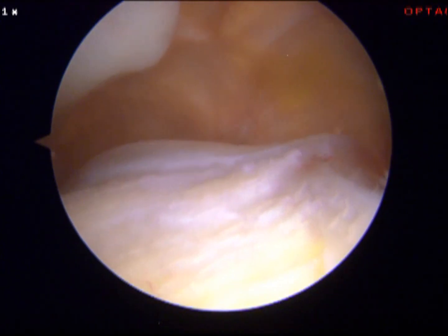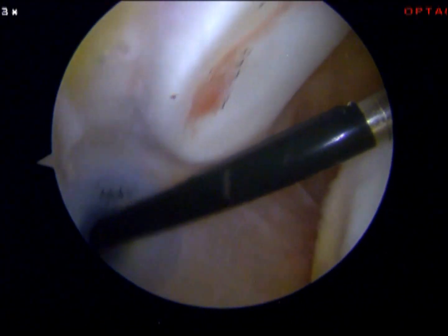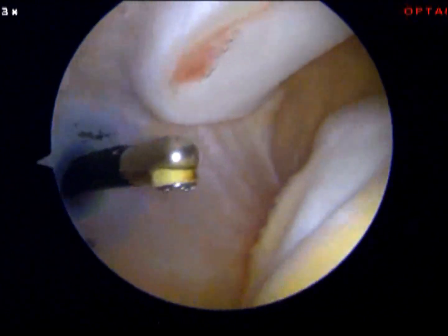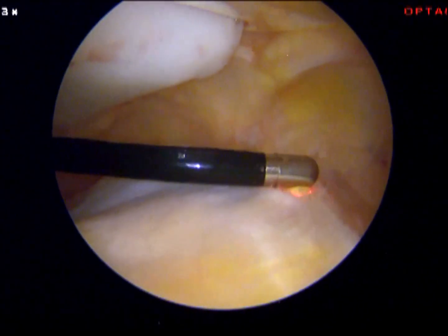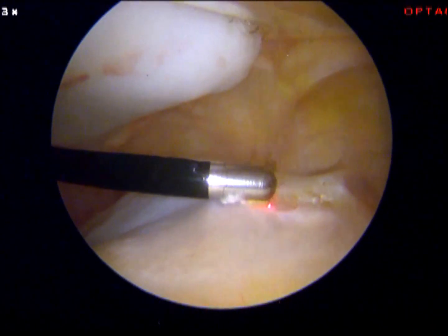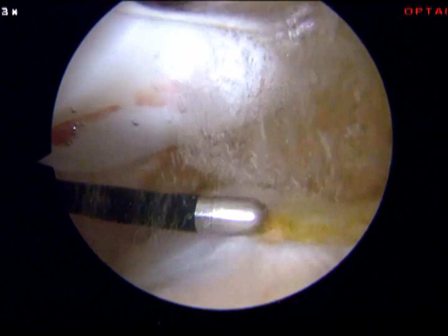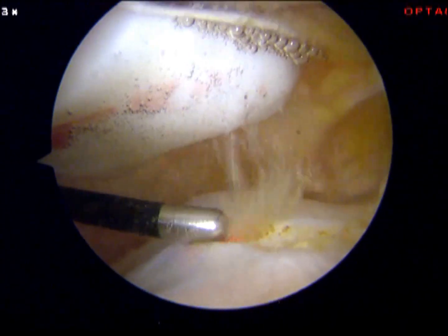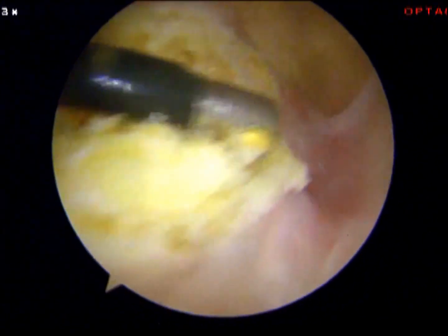First of all, we start looking from the suprapatellar pouch — that means above the knee — and you see this flat trochlear. Above here you see the patella, the kneecap, and here you see the trochlear. This radio frequency device is going to take away the synovia above the trochlear.